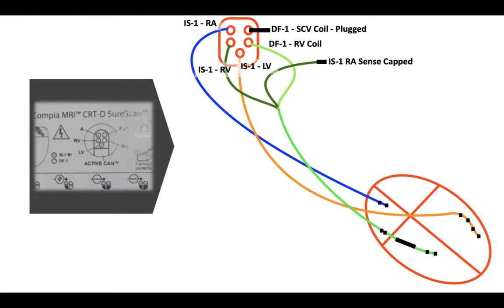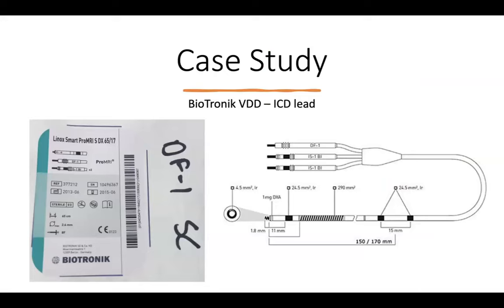I was not telling them that it seemed this lead had an issue. But what is the issue with the lead? I don't know. These are leads that have expired, so you don't know whether something is wrong with the lead. So I just said, get me another lead. Let me test the same thing, because we tested our cable wire and I felt that the cable wire was not the problem.